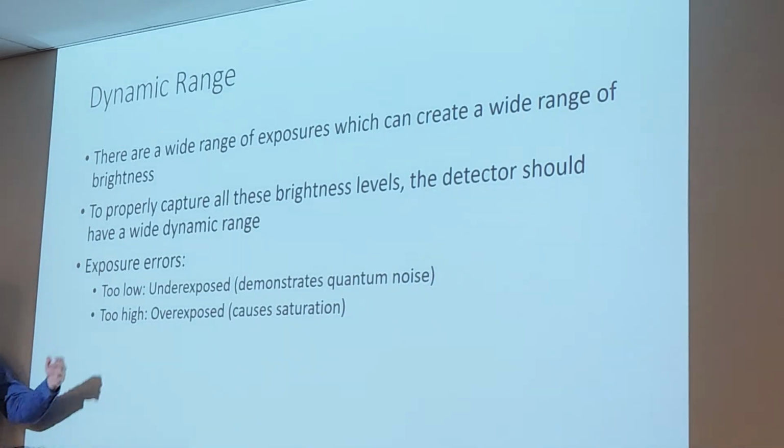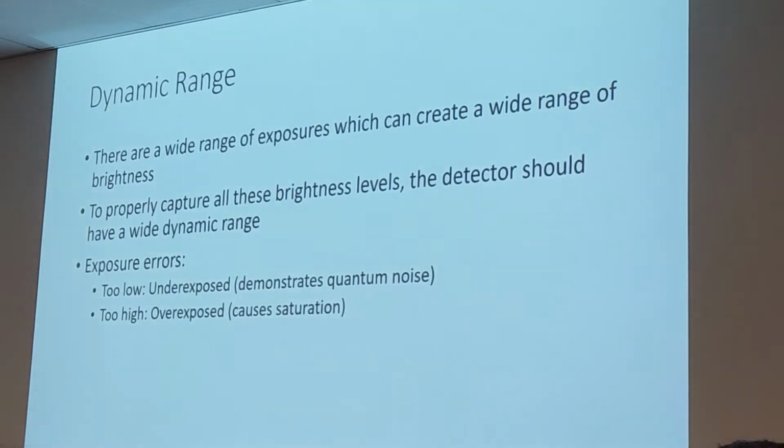Maybe setting up an abdomen technique and then shooting a chest, overexposure. Or, and this is something really bad that you haven't really gotten into yet, selecting the wrong AEC will cause overexposure. What AEC is, it's a way for us to ignore having to set our own exposures.